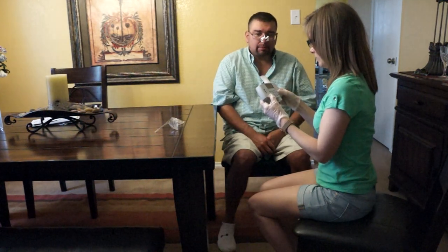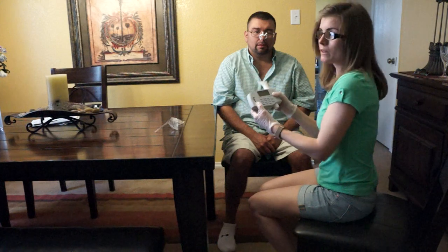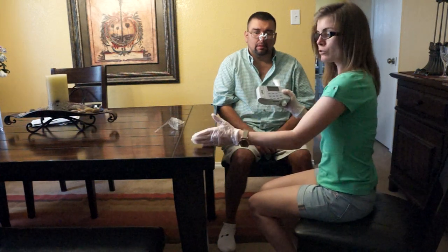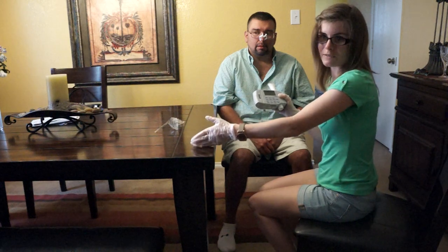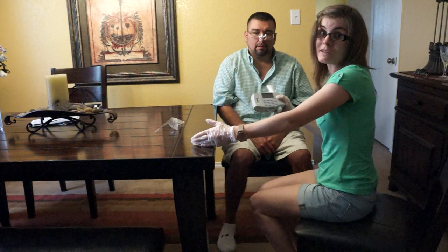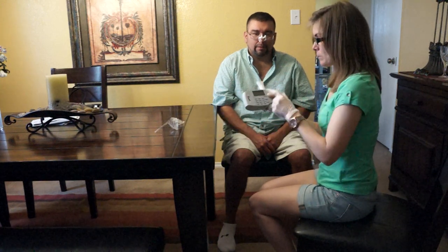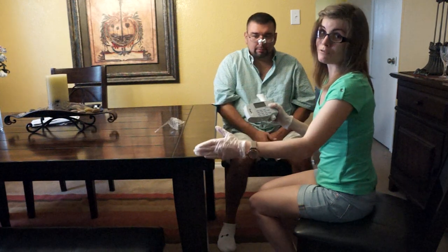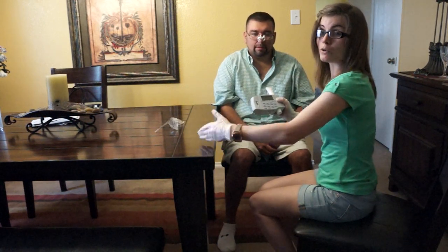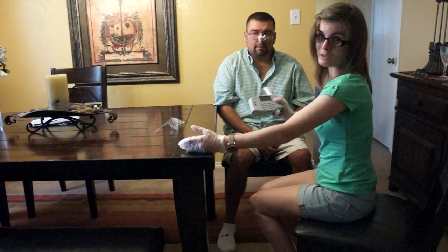Okay, so it's giving us a session quality C, good effort. The reason why it's giving us a C is because it'll rate it each time. Usually the first effort will be about a D. Then the second effort, if it's good, will be about a C, or it could be a D depending on the effort. But it's still waiting on three efforts. You want to get three good, accurate tests before it'll accept it and say, great session, great job, session complete.